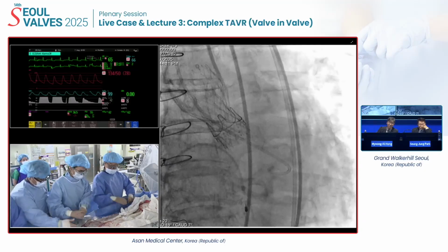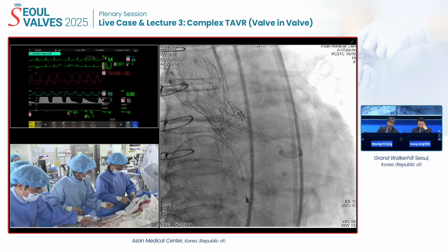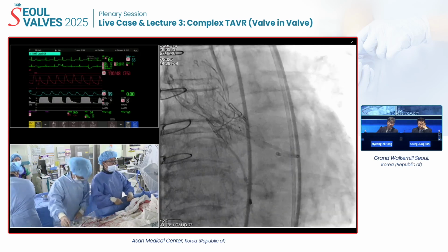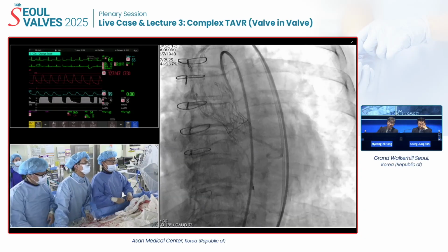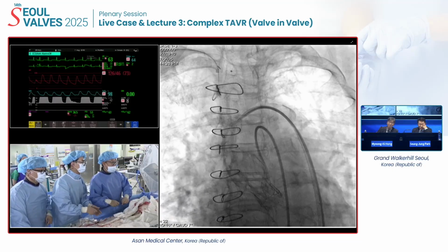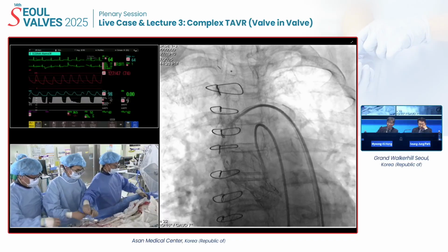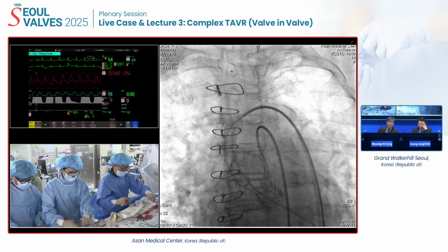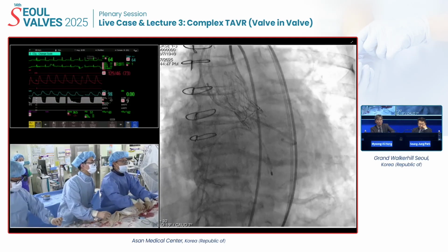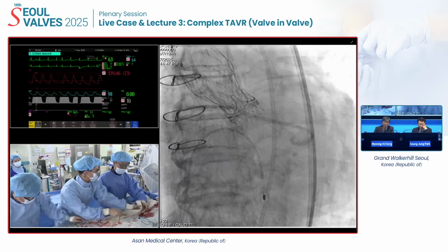자, 빼고 여기 카스터 주고, and remove the left diagnostic coronary catheter, and then remove the right diagnostic catheter, and then finally check the coronary artery view. 오케이. 어디 있지? 라디알. 라디알 있구나. 자, 이거 뺄게. 잠깐만. 됐어. 그다음에 요거 이제 라이트도 뺄게요. 자, 오케이. 이거 보여주고. 자, 오케이. 줌하고. 알겠습니다. 이렇게 놓고. 자, 보자.